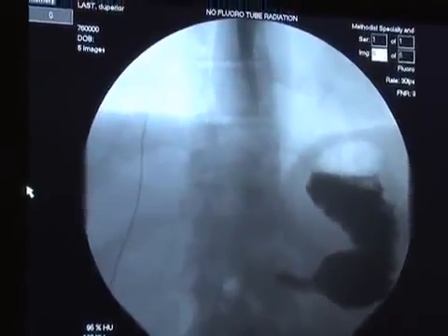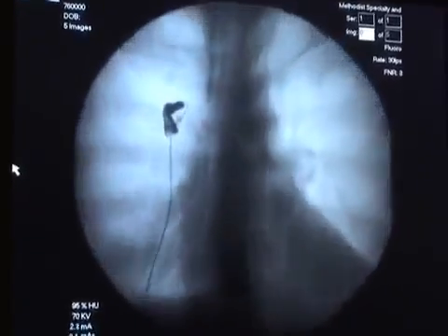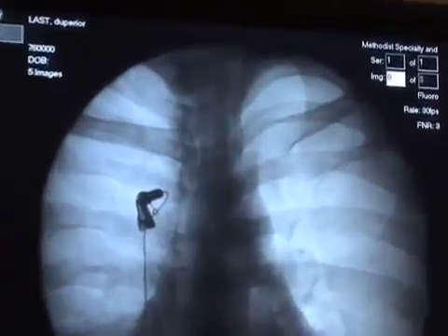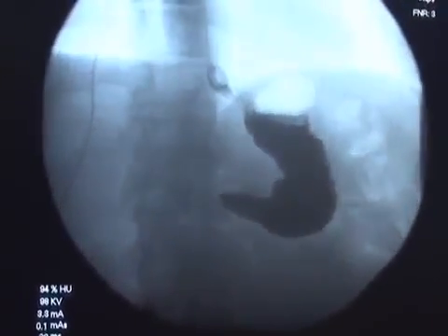The last step I want to take here is to film the entire esophagus. Please go ahead and take one more swallow, and watch the peristaltic wave carry the barium through the esophagus into the stomach. Do I have a hiatal hernia? You do not. All right.